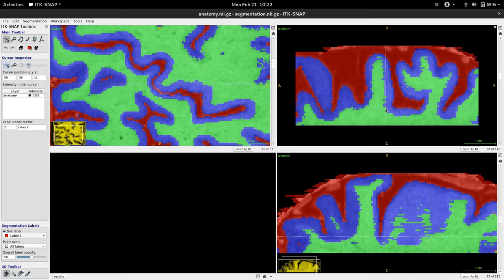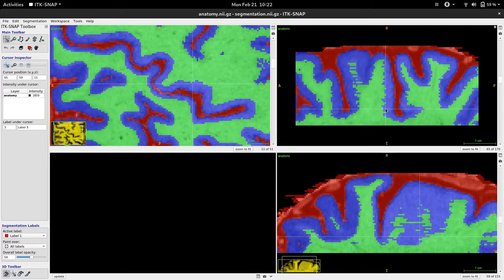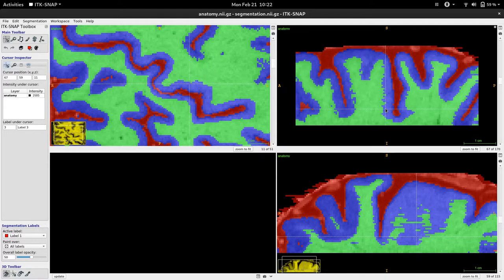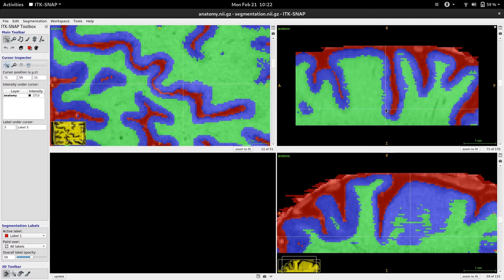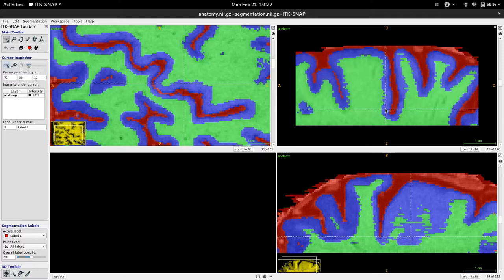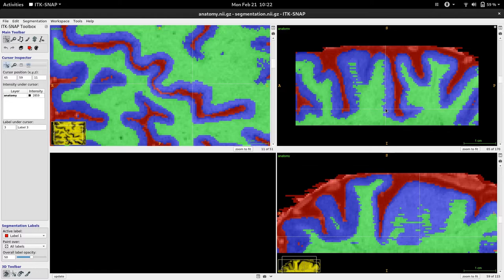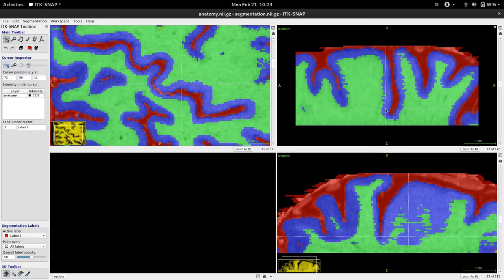This normally happens when someone does manual edits on the segmentations coming from automatic algorithms because the accuracy and precision of the gray matter and white matter segmentations might not be ideal for high resolution imaging.